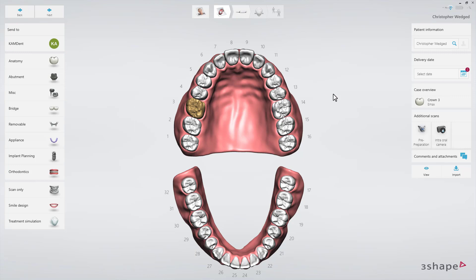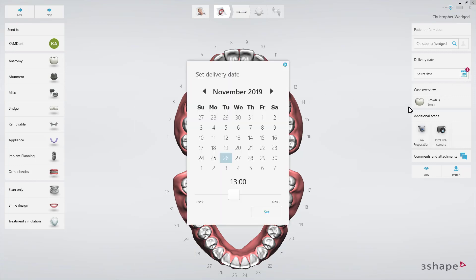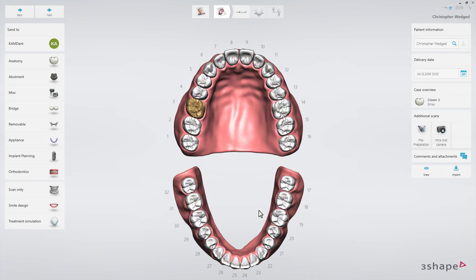Set the delivery date by clicking the Delivery Date button. You can add a pre-preparation scan by pressing the Pre Preparation button. Make sure to do so before starting scanning.